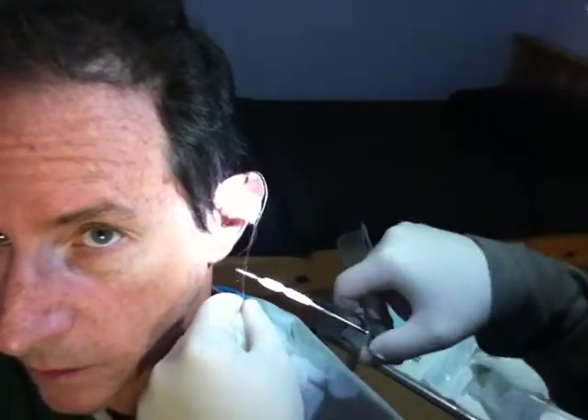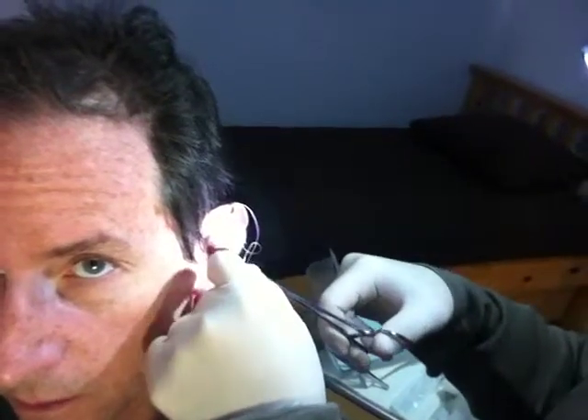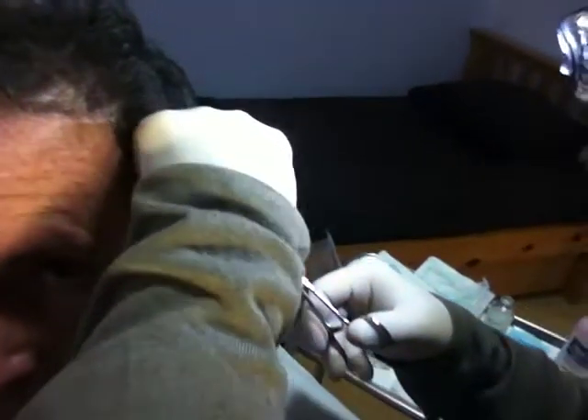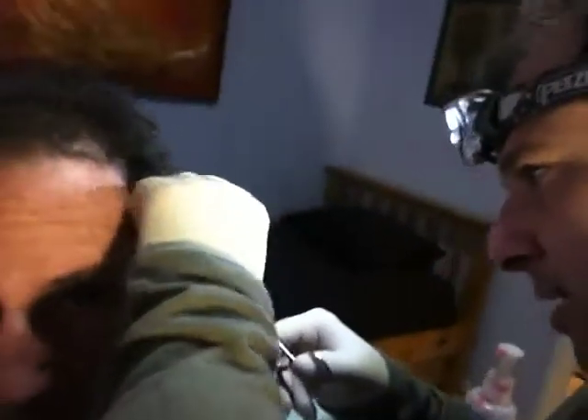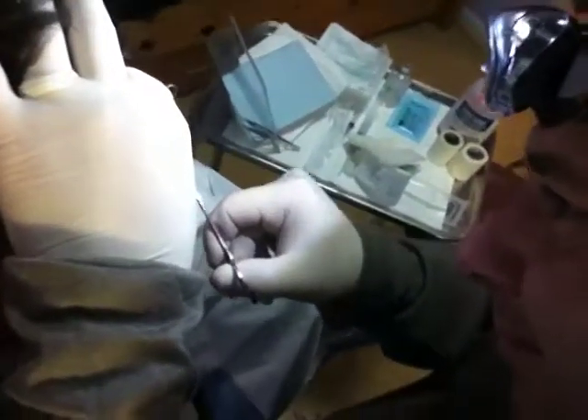So this next one will be in the cartilage — if I can get it on the other side. I was able to get it on that side. It's difficult too because the blood obscures everything. I'm so sorry about that. I'll put some of the camera on and see if it catches anything.